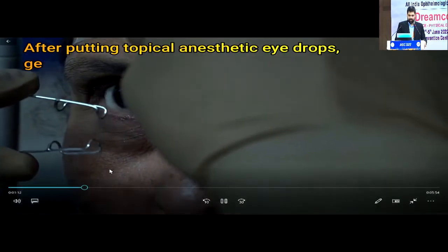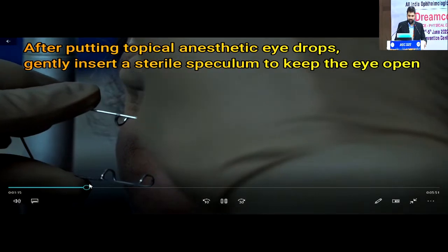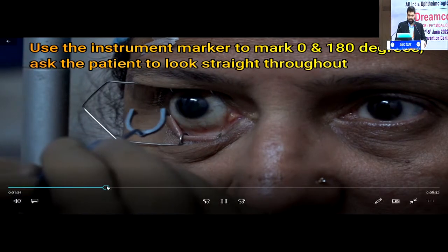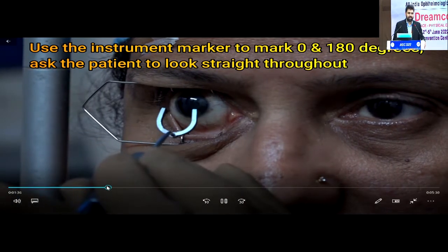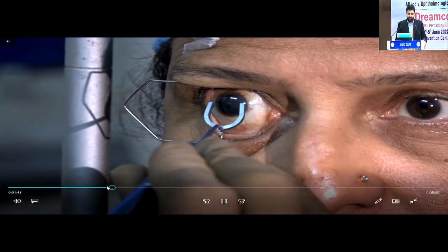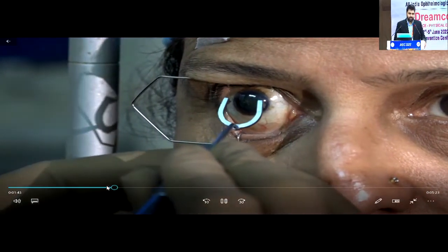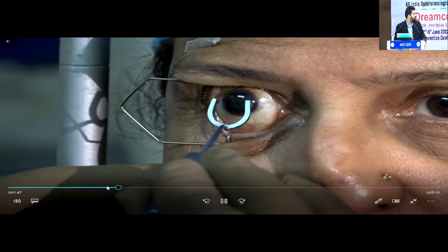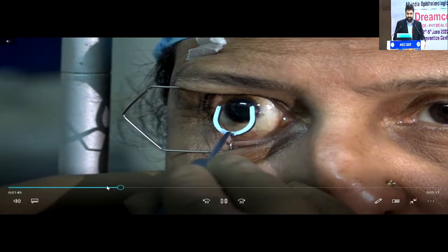You should dry the area well after you've put your paracaine eye drops, and putting a speculum, at least in the beginning, is really important. You put the speculum, you make the patient sit at the slit lamp so the chin is stable, and this is just showing you how you can use one of the gravity markers. And the inks are there. This is for 0, 180 degrees. Ask the patient to look straight. Probably you can put in a torch light and just mark it at 0, 180.